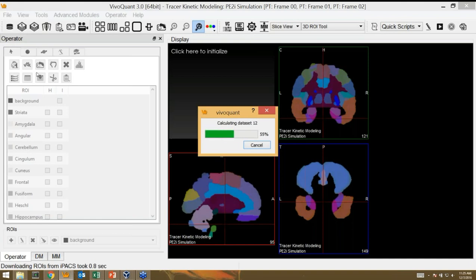They were just relative to frame numbers, so the time activity curve could essentially become very misleading. What we've done is add this frame time editor for the dynamic data. If we have that information in the frame time editor, when we go to plot the data, it will include that. So the time activity curves will be more useful and more presentation ready, or even just assessment ready, without having to redetermine what everything is.